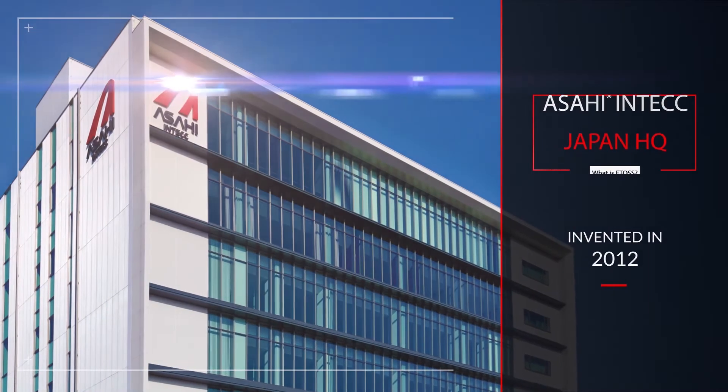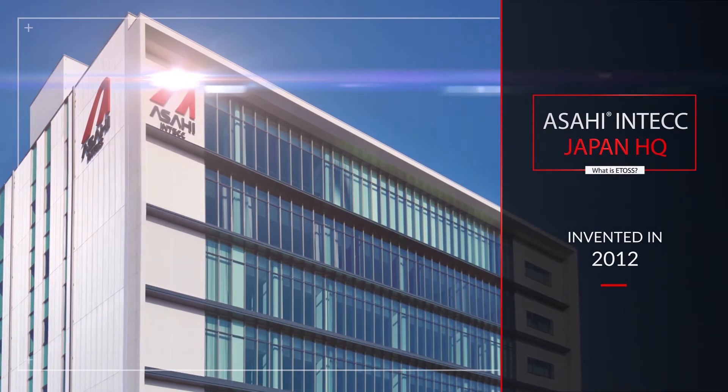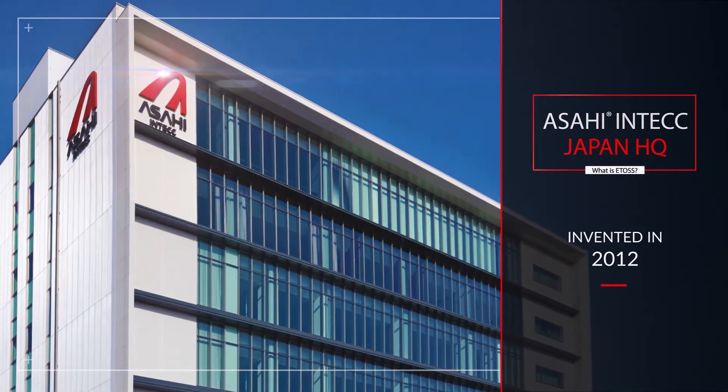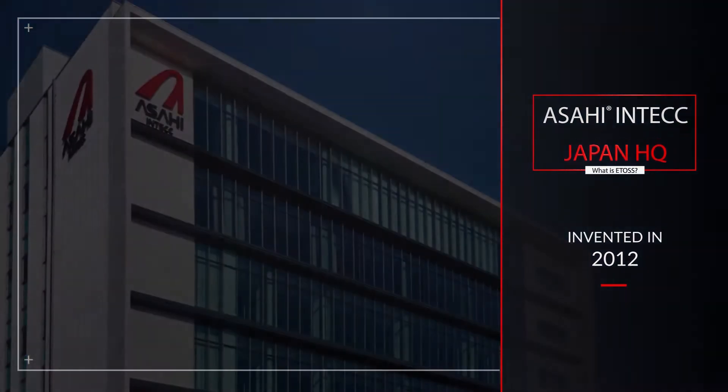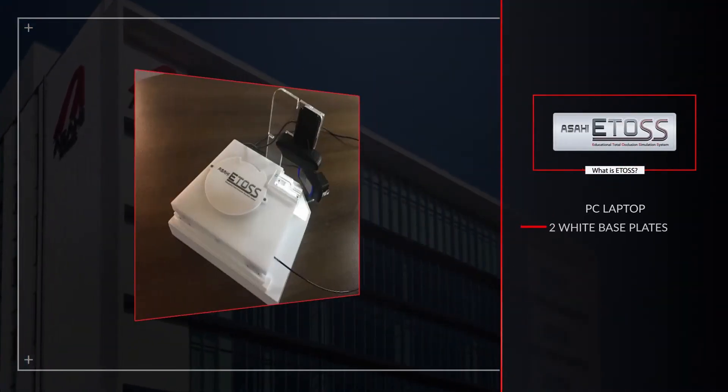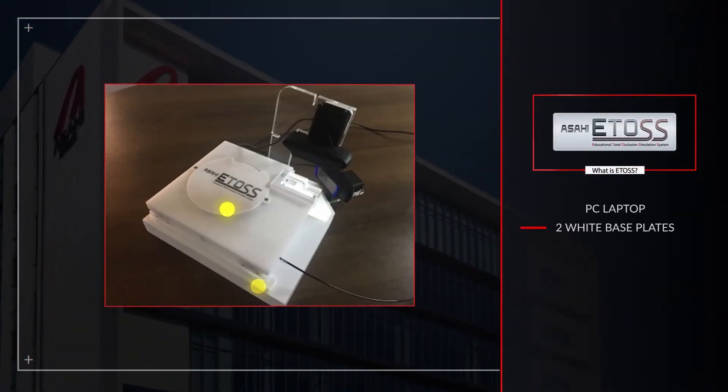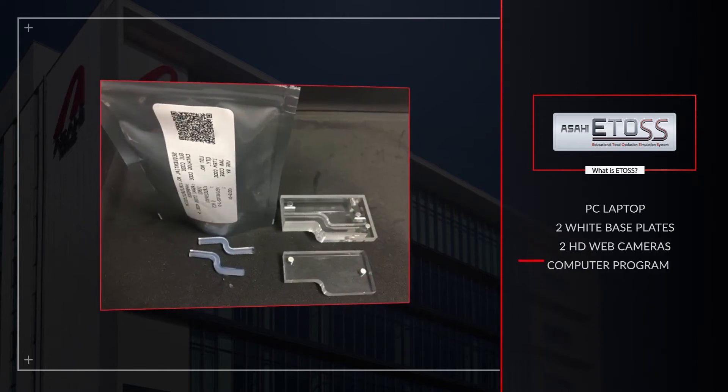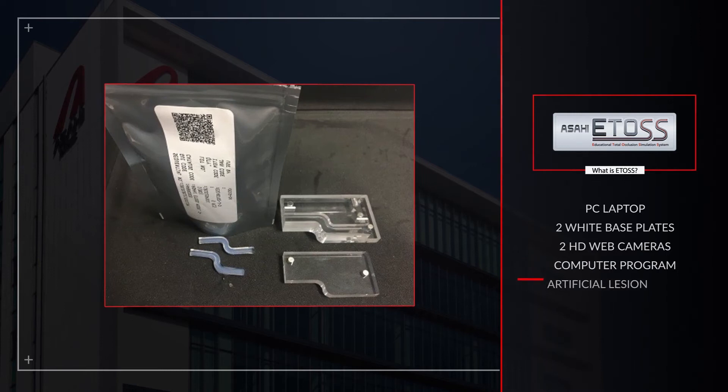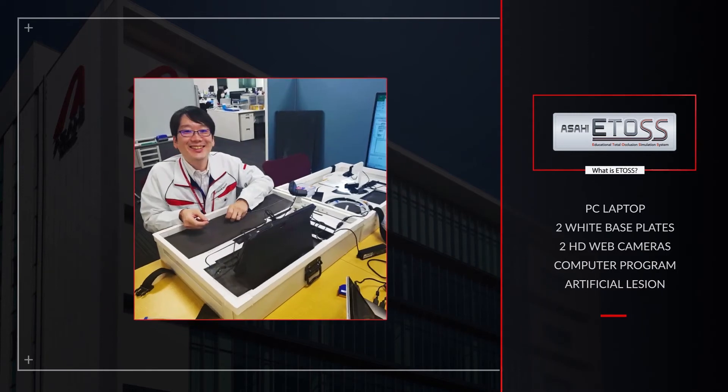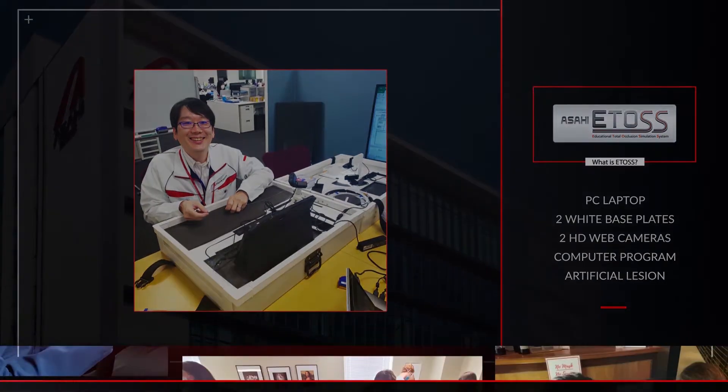Invented in 2012 at Asahi Intech's headquarters in Japan, eTOS consists of a PC laptop, two white base plates where normal-length devices are rolled and installed, two HD web cameras, and a computer program and artificial lesion that was also created at Asahi Intech headquarters.